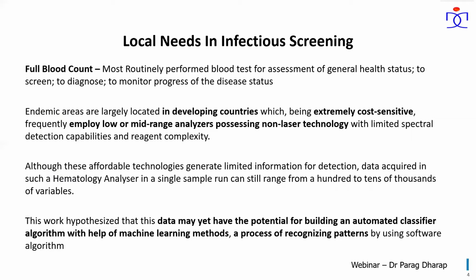Although these affordable technologies generate limited information for detection, data acquired in such a hematology analyzer in a single sample run can still range from 100 to tens of thousands of variables.